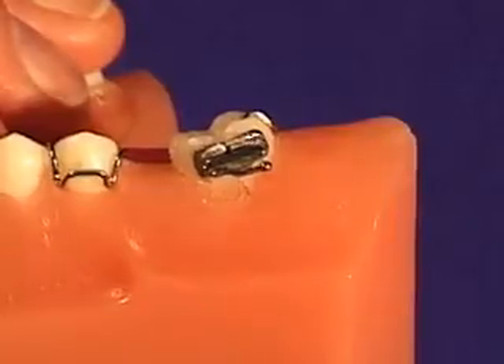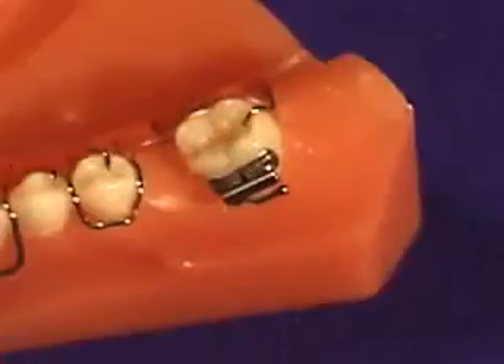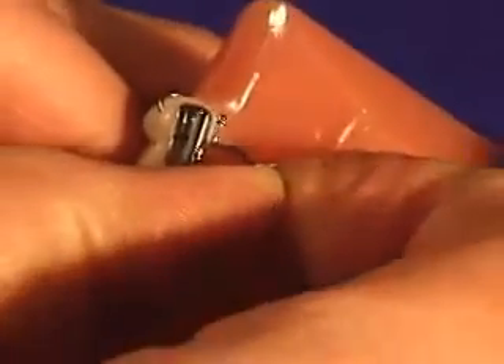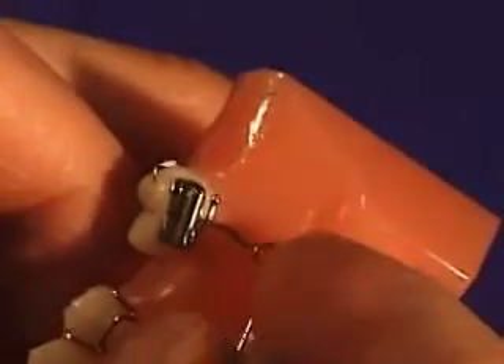First, the removable appliance is placed and checked. The bracket is cemented, and the spring can either be placed into the bracket outside of the patient's mouth prior to cementation, or it can be placed after the bracket has been cemented.